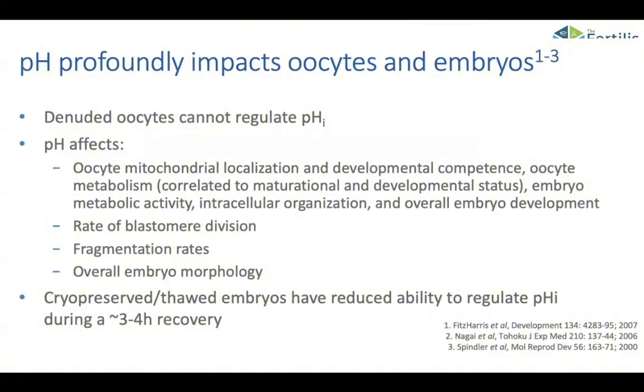So this is about pH, and it is also said that when you warm an embryo, it takes a while to regulate pH. Initially, it has no property to maintain the pH. So you have to maintain the pH externally, but the internal pH takes around 3 to 4 hours to recover.